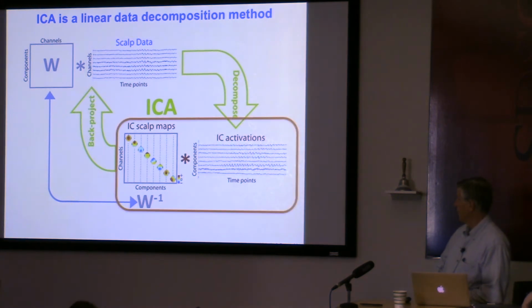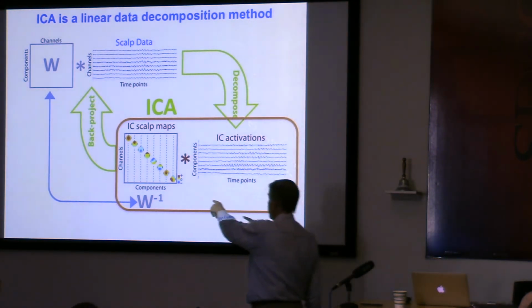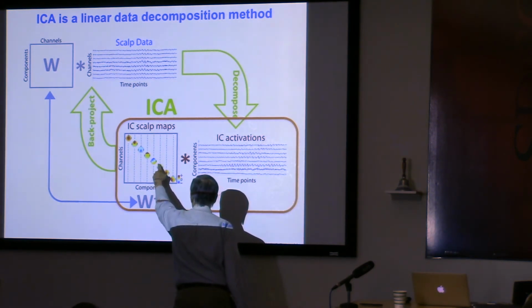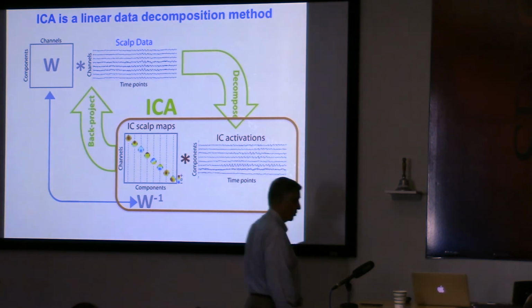And the same for the projection for the polarity. We show the maps here for convenience in a single polarity, but when it's multiplied, for instance, by negativity, then of course this becomes blue, red, and this becomes blue, and so on. It will flip as it's multiplied by this time course.